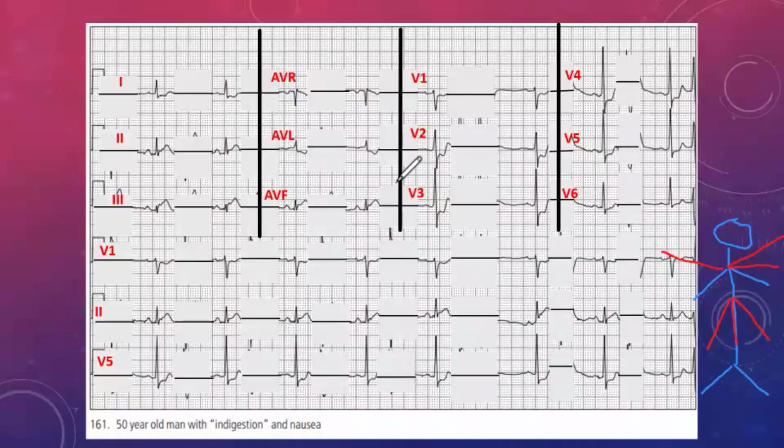All right. Now, let's look at our chest leads. So we've got V1 and V2. And if we were to draw our chest, let's just draw our chest over here. So this is a cross section of our chest. And then let's put our leads in there just so that we can see. So we've got lead 1, lead 2. I'm just indicating them like this just so that you know. Lead 3, lead 4, lead 5 coming in from this side more or less, and lead 6. So these are the points of view that they are looking at the heart from.